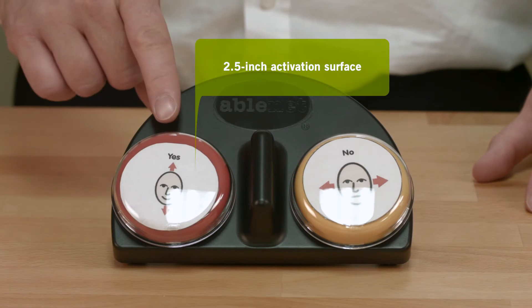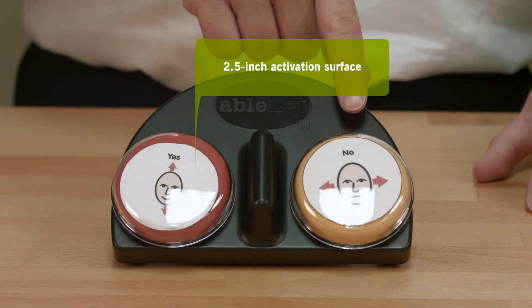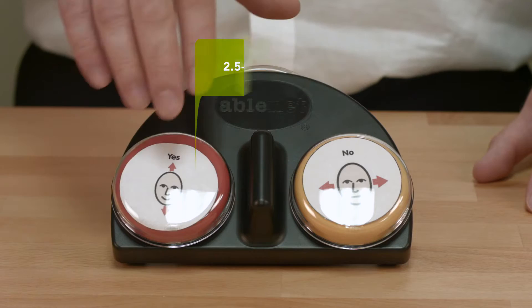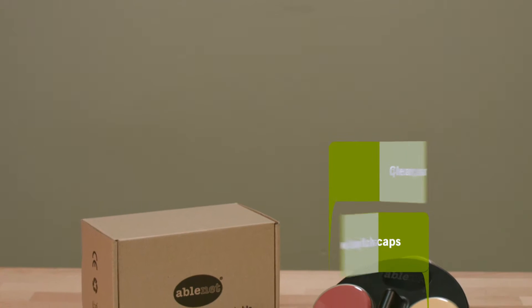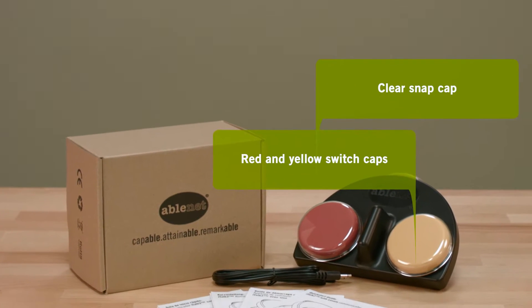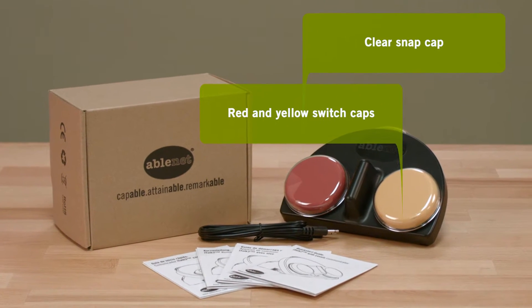On the iTalk 2 with Levels, both switch top activation areas are two and a half inches in size and are separated by a small ridge to help prevent both from being activated at the same time. Included with the device are red and yellow switch tops along with two clear snap caps that enable picture symbols to be attached to the device.